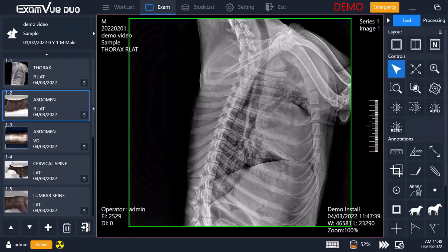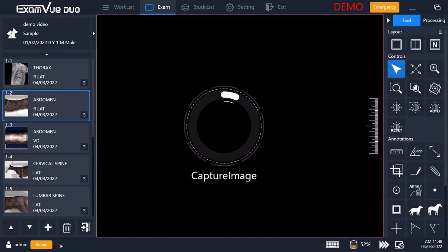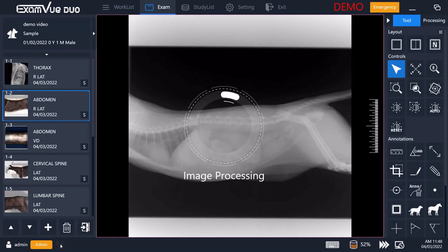If you are not sure exactly what technique you should use or how to position the animal, you can double click on an upcoming X-ray and it will bring up the positioning guide and the technique chart for that body part. This will show you exactly how to position the animal, what your X-ray should look like when it is done, and will give you the suggested technique for small, medium, large, or extra large animals of that species. You do not need to close this — simply taking your X-ray will make it move on and show you what you've taken.